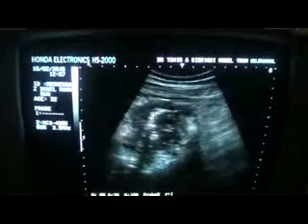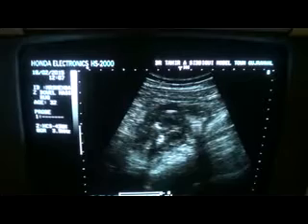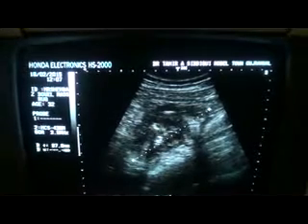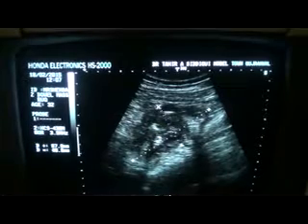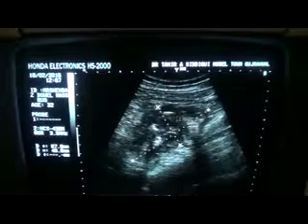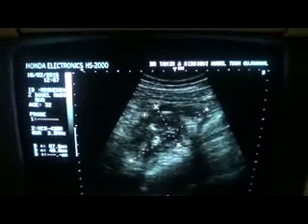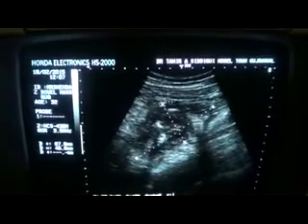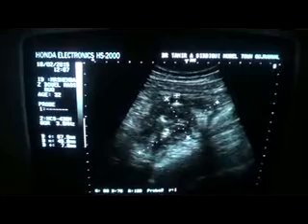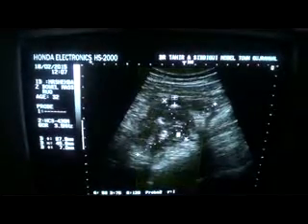And this is a typical appearance of a bowel-related mass, that of the colon. It measures in longitudinal section approximately 8.7 by 4.5 centimeters. This is the bowel wall. The wall is irregular and measures approximately 7.0 mm. More than 5 millimeters is considered to be pathological.